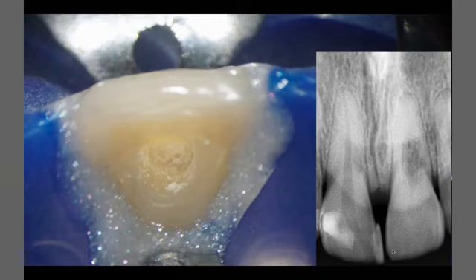As usual, start with your initial outline. In anterior teeth it is a different story. Why am I showing this case? Because in anterior teeth, the calcified tissue forms a ring calcification. It's called ring calcification. We have a dark spot. We don't have a floor map here, so we will not see the floor map because this is a single-rooted tooth.